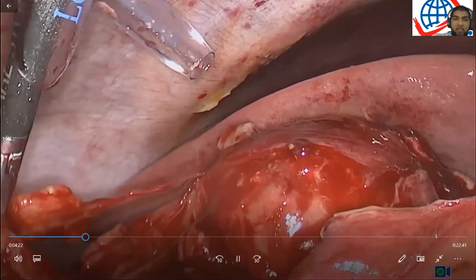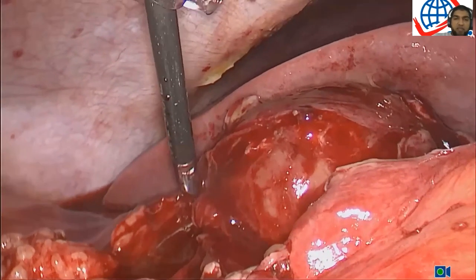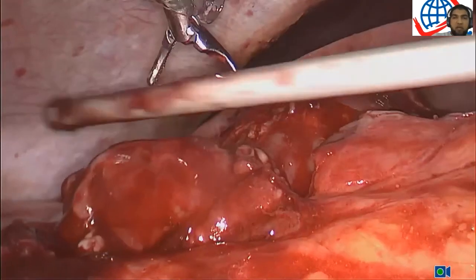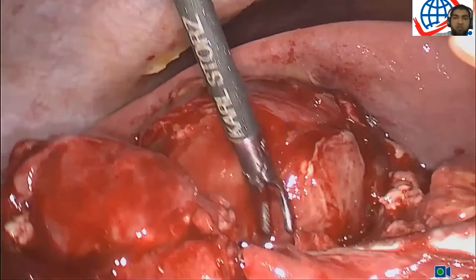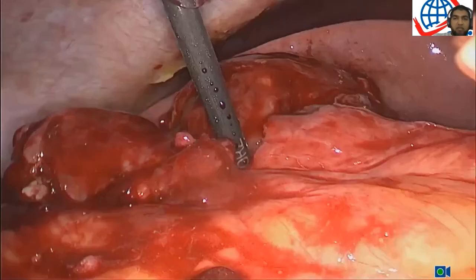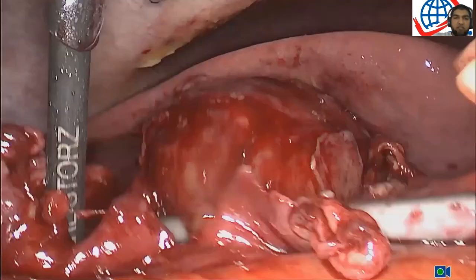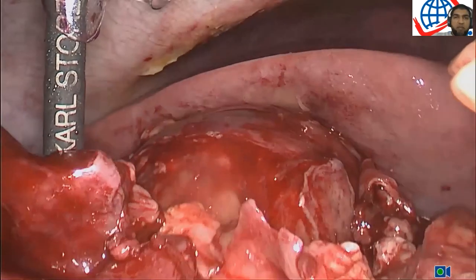So here we can see all the movements are now geared to try and separate the gallbladder completely away from the omentum. And if you look at what we can see now relative to when we started the operation, you will find that at least you can see more of the gallbladder, and you can see the cholecystitis. You can see how friable the tissues are. And you can see the fluid in the tissues. And these are all features of an infected gallbladder. And as I mentioned already, this is a case of a gallbladder empyema.